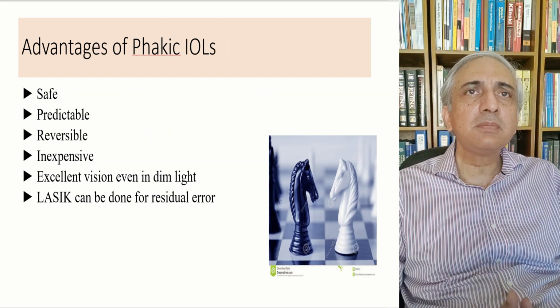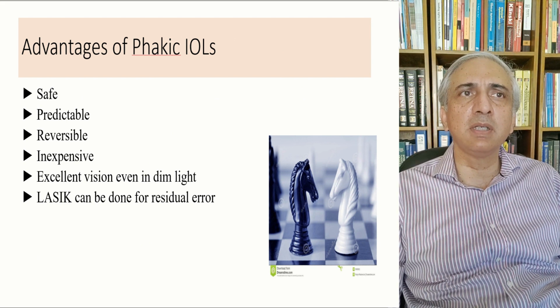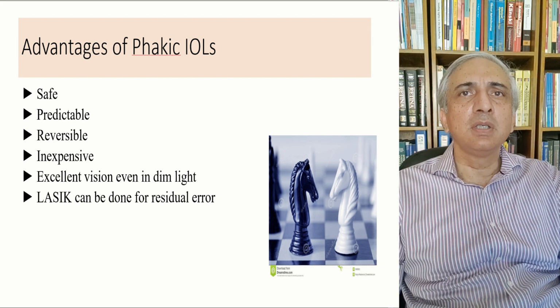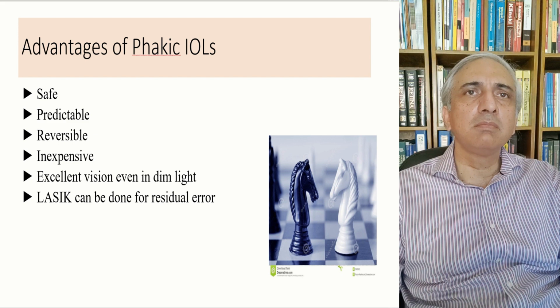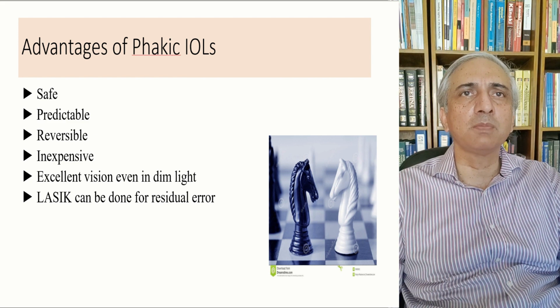Surgery advantages are: it is safe, it is predictable, reversible, inexpensive, excellent vision even in dim light, and LASIK can be done for residual error. So this is another surgery in your armamentarium to correct refractive problems in patients.